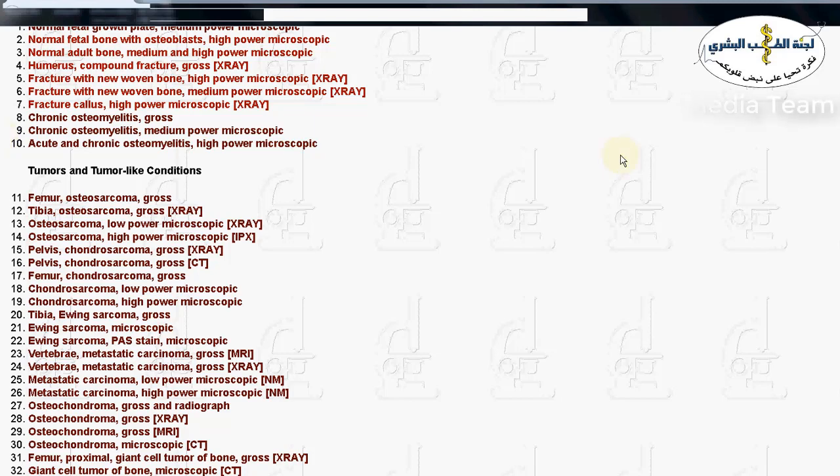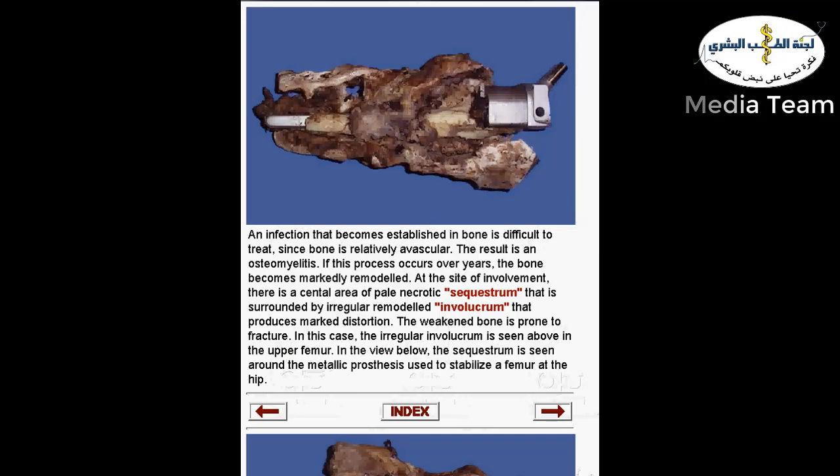Now we are talking about the musculoskeletal system, and we are going to cover some pathology pictures regarding benign and tumorous lesions that can happen in bone and the skeletal system, including benign and malignant tumors. First of all, here you can see this is a part of the femur bone. Inside this bone is a metallic prosthesis that was inserted due to a severe fracture in this patient.